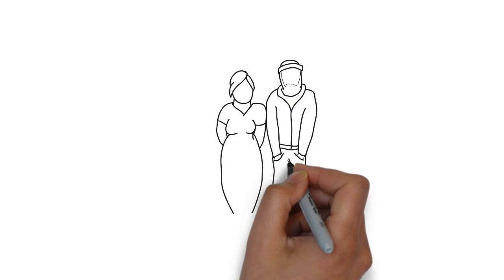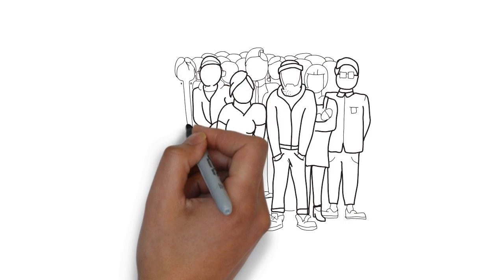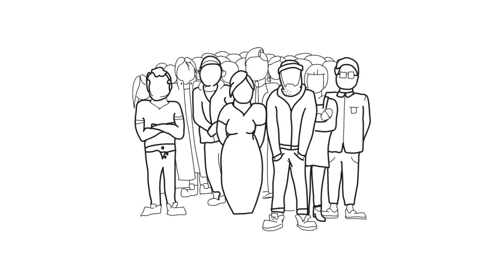If using patients, we need to measure at least 10 patients, who are all around 70 kilograms in weight. That means no kids.